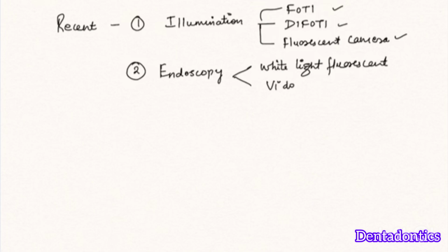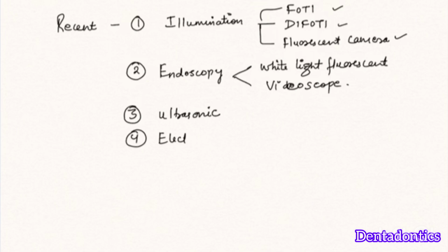Then we have ultrasonic waves to determine dental caries. Then we have different types of instruments to detect electrical conductance measurement, like caries meter and caries scan pro. In the caries meter, if there is green light, there is no caries, yellow light, enamel caries, orange light, dentine caries, and if it is red, then it involves the pulp.